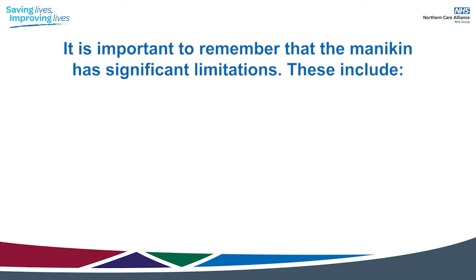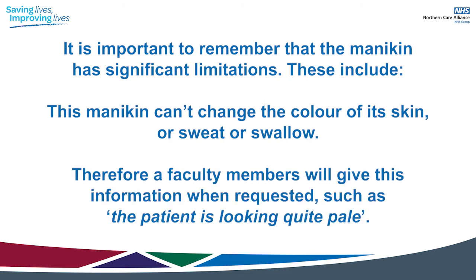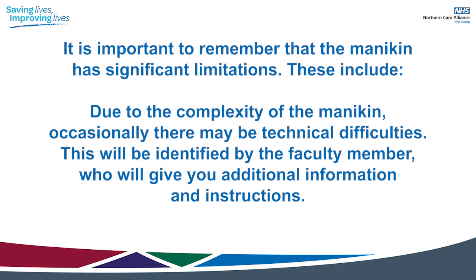It is important to remember that the mannequin has significant limitations. These include: the mannequin can't change the colour of its skin, or sweat, or swallow. Therefore, a faculty member will give you this information when requested, such as the patient is looking quite pale. You cannot physically take bloods from the mannequin. However, get all your equipment prepared, take it over to the patient, and verbally indicate what procedure you are doing. Due to the complexity of the mannequin, occasionally there may be technical difficulties. This will be indicated by the faculty member, who will give you additional information and instructions.